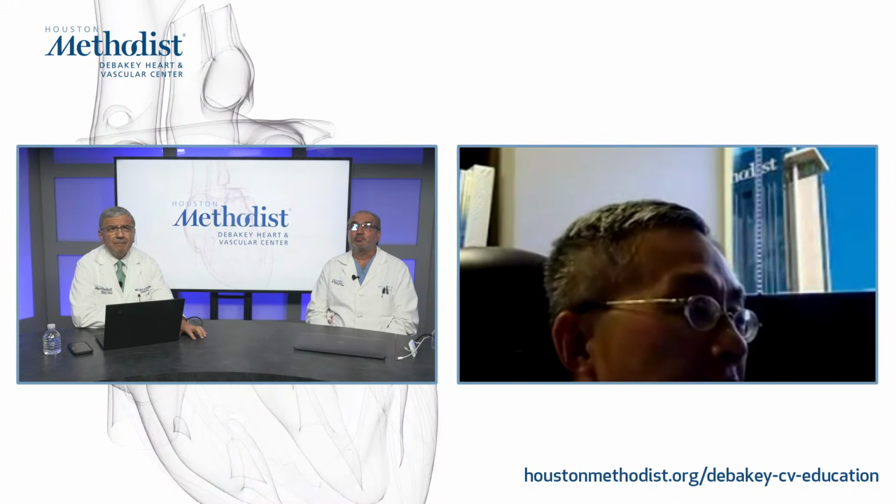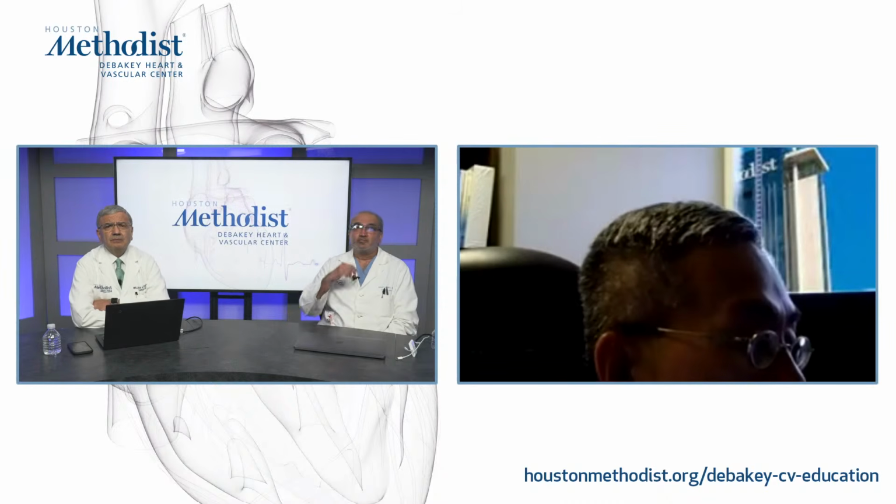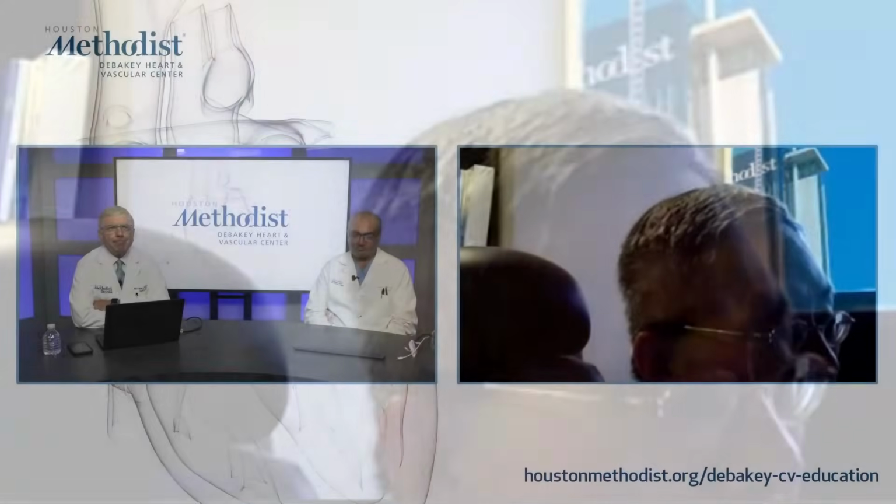Thank you. That's a very good question, Dr. Zoghbi. I think one thing we can do without contrast would be the opening angle and closing angle, same thing the interventional cardiologists used to do with fluoroscopy. So for opening angle and closing angle of a mechanical bileaflet valve, you don't need contrast.